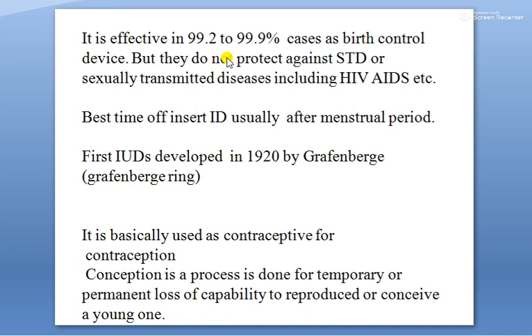Here you can see they do not protect against STDs, that is sexually transmitted diseases, including HIV and AIDS. So basically this is a disadvantage, or you may say it is not a disadvantage, it is an insufficiency of a particular device, right?